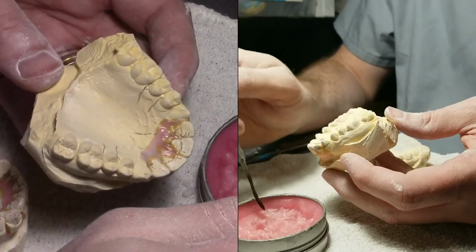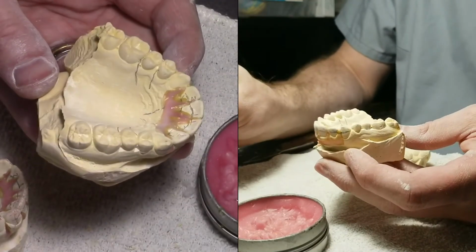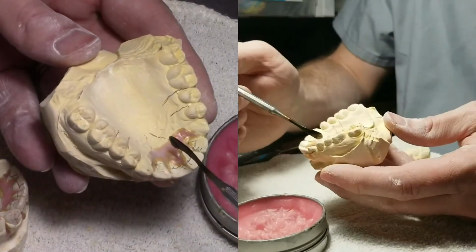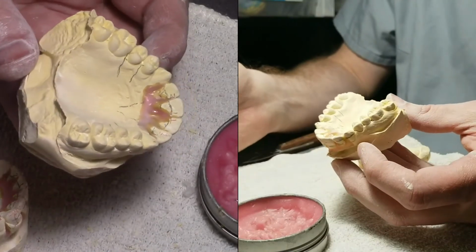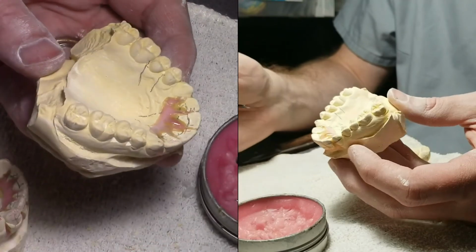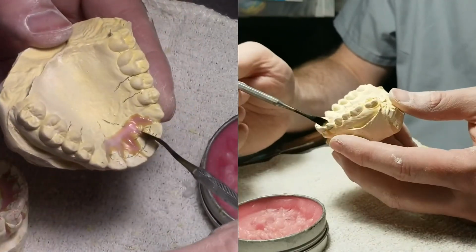This is the part of the video where I would fast forward it. There you go. Put that back on there. Now if you want, get in the habit of taking pictures before and after, and you can always reference the picture when you're resetting the teeth.